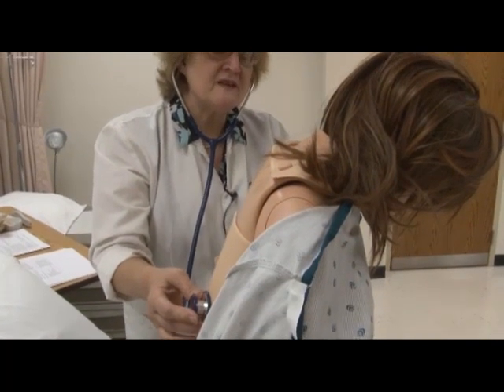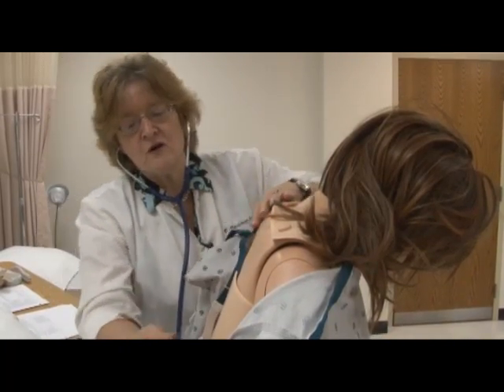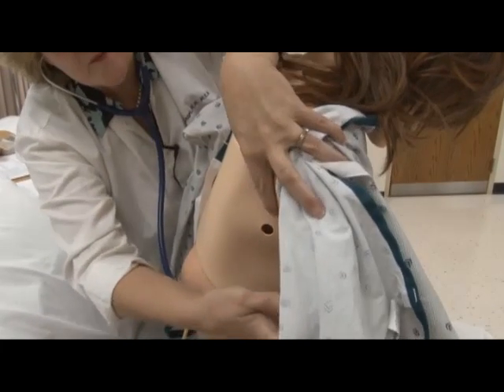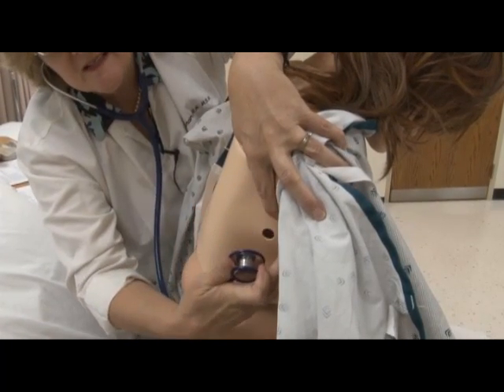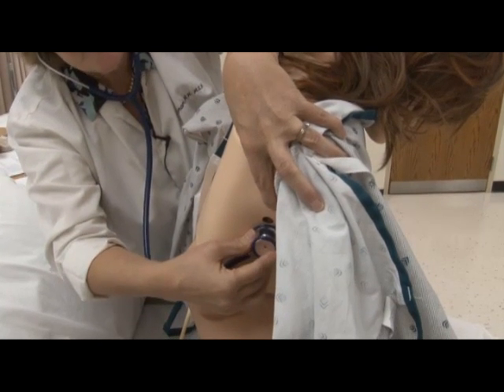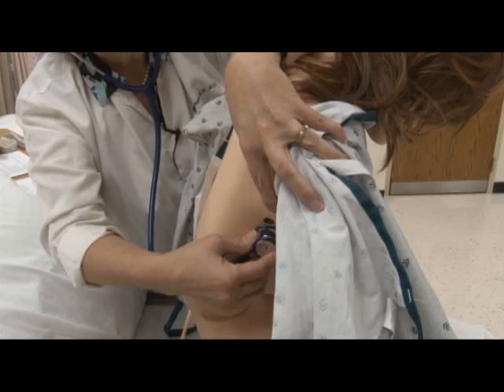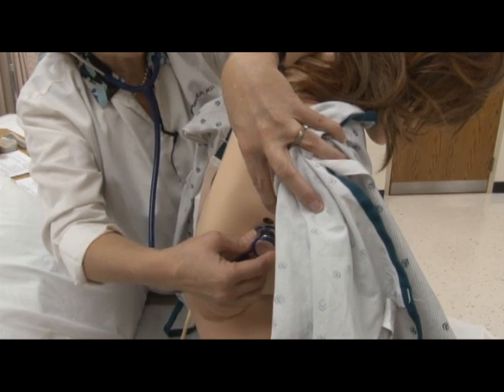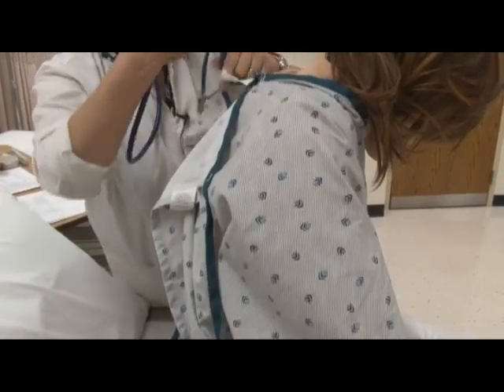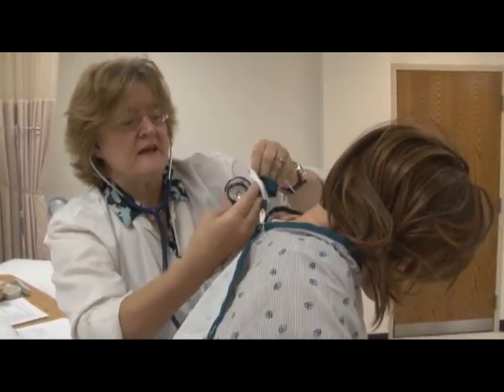I have one more site that I need to get. It's going to be underneath your right arm, so I'm going to ask you to raise your right arm. Under the mid-axillary line at about the fifth intercostal space, I'll place my stethoscope. That is going to get the middle lobe on the right side. Let me re-tie your gown.